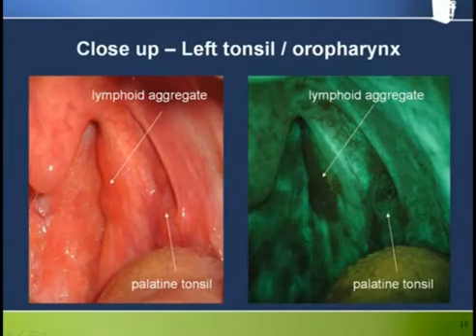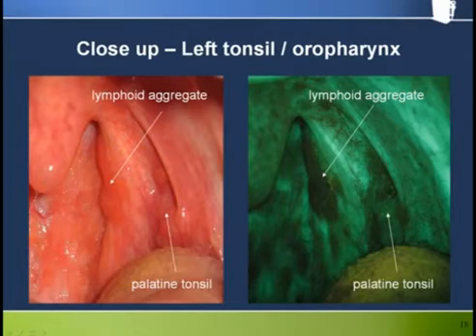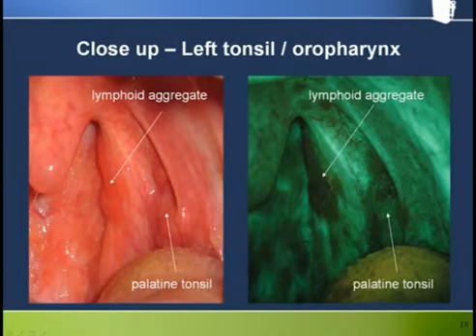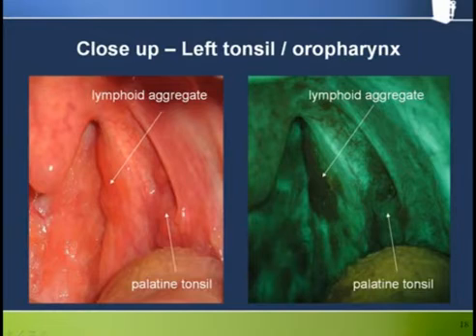This is the same patient with a good view both in white light and with fluorescence of the palatine tonsil and oropharynx. The somewhat alarmingly dark area on the rear pharyngeal fold is just another lymphoid aggregate and it's also quite evident under white light.